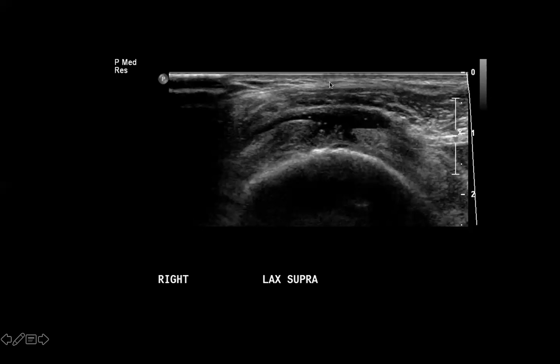Starting here we have the subcutaneous fat, then the deltoid muscle, and then this bright hyperechoic line here is the peribursal fat. There can be a potential space here if there's fluid, and that space is the subacromial-subdeltoid bursa. If there's inflammation around the shoulder, this peribursal fat can expand and result in fluid in the subacromial-subdeltoid bursa.